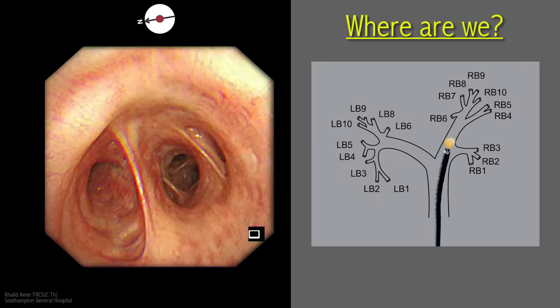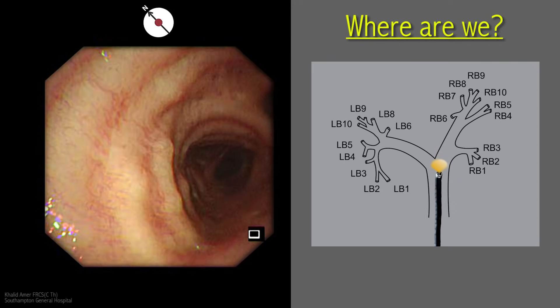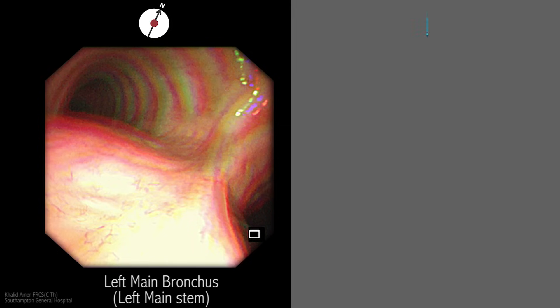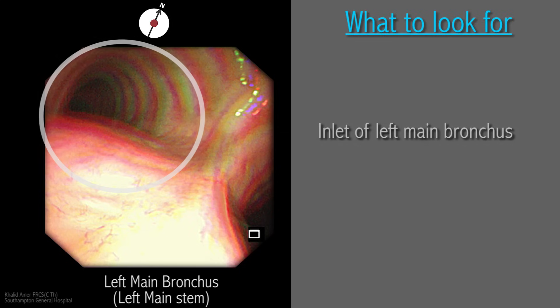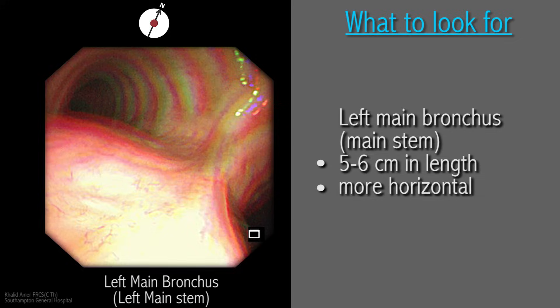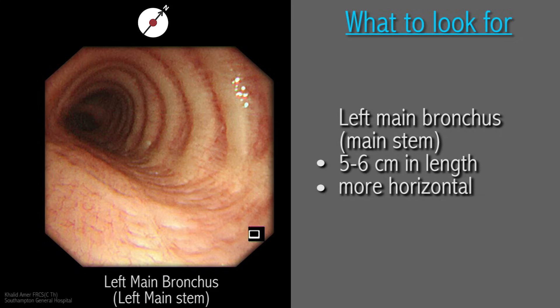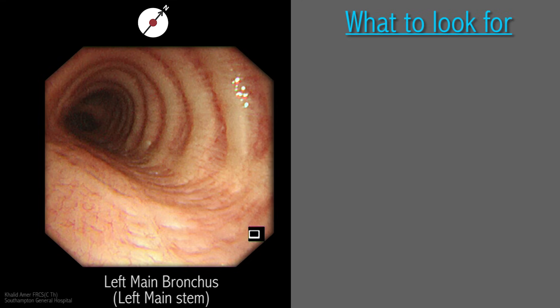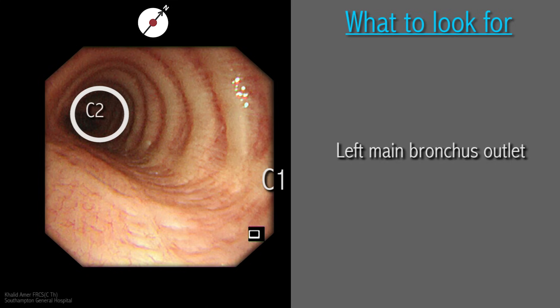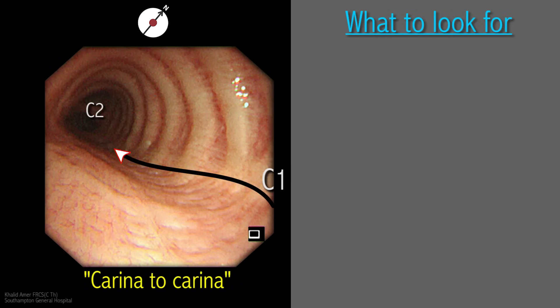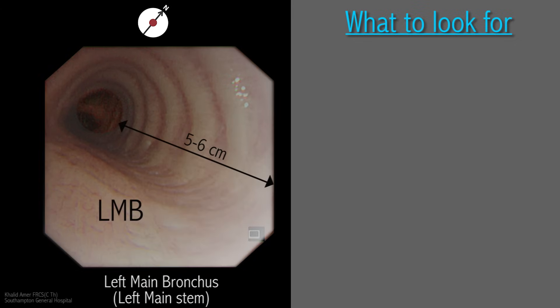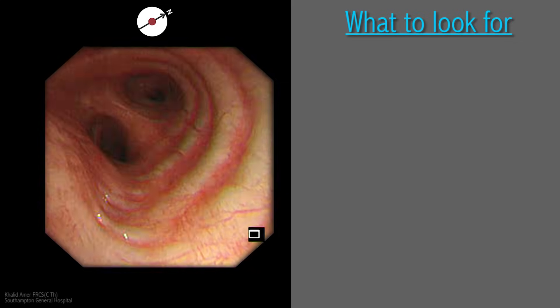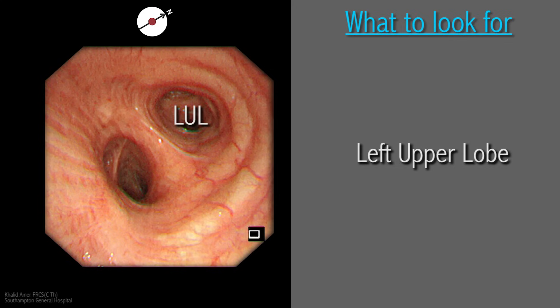This concludes examination of the right side of the tracheobronchial tree. The scope is withdrawn back just above the carina in preparation to engage the left main bronchus. The left main bronchus is longer than the right, spanning 5–6 cm, and takes a more horizontal orientation. To define the territory of the left main bronchus we follow the same principles: defining the inlet and outlet by identifying the related carinae. One can see at the far end the secondary carina C2 between the upper and lower lobes. C2 defines the outlet of the left main bronchus, and the surface area from carinae to carinae makes up the left main stem.